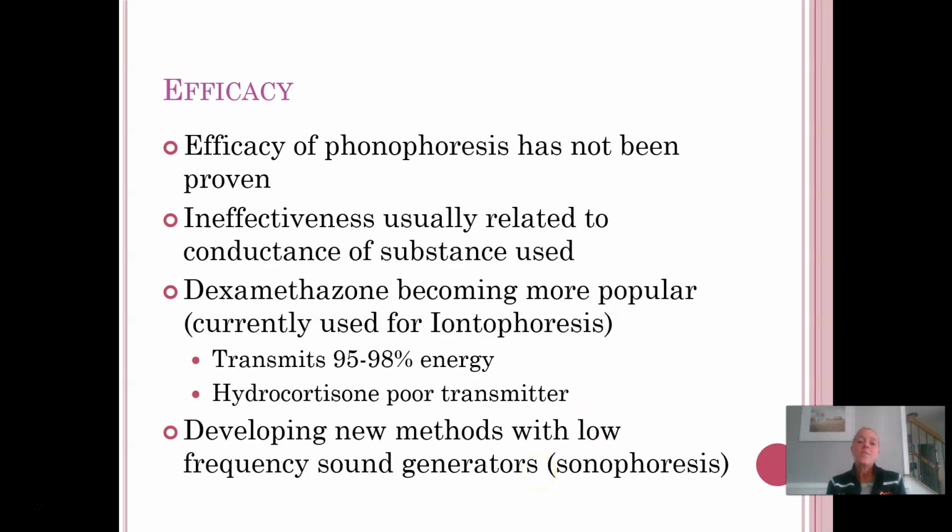So the efficacy of phonophoresis really hasn't been proven. We did actually prove that what we were doing didn't work so well, so then we kind of stopped doing that. And then, like I said, ionto came around, so now we pretty much just use that instead. The ineffectiveness of phonophoresis was, again, usually related to the conductance of the medication that we were using.